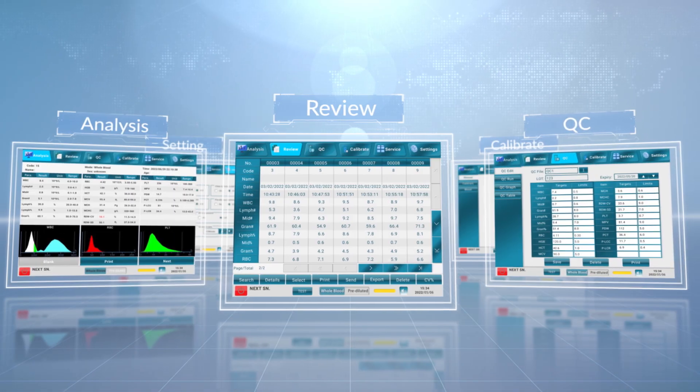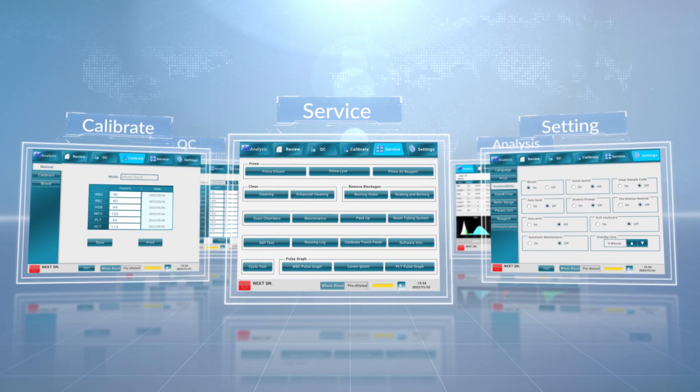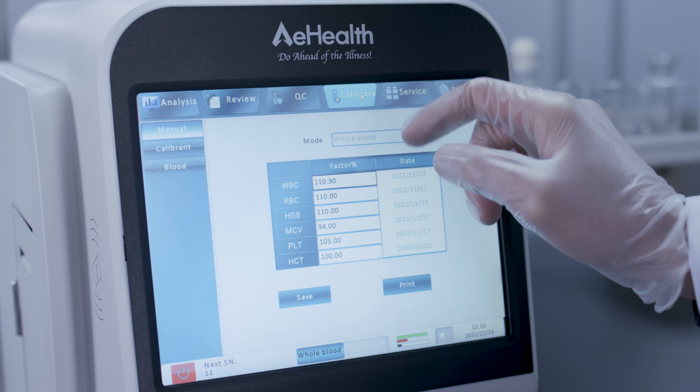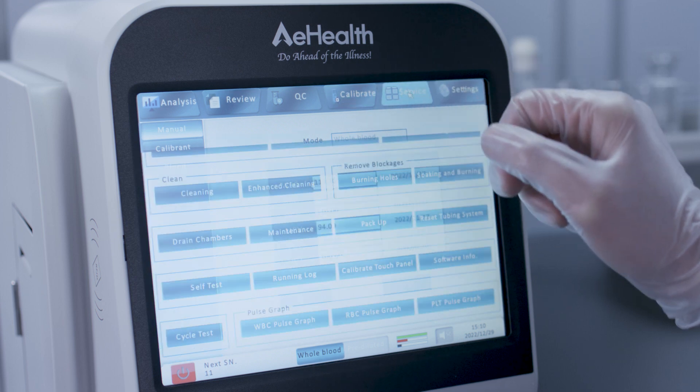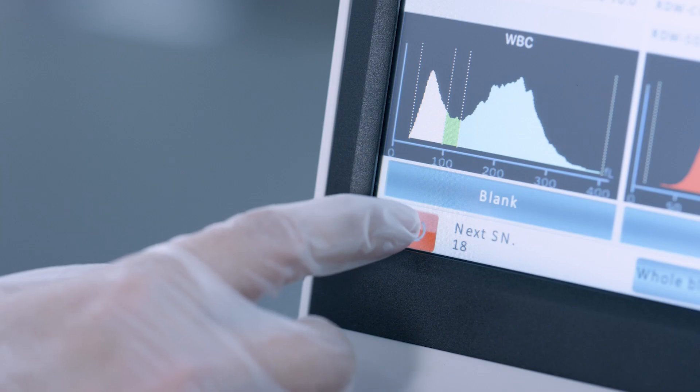AirC3 has a quick access design. The system can reach any interface within 3 steps. All user and engineer buttons are clearly shown on the service interface at a glance, making maintenance easy.